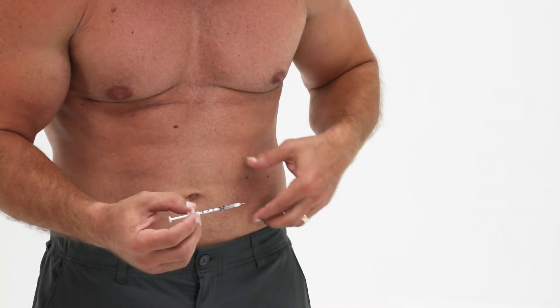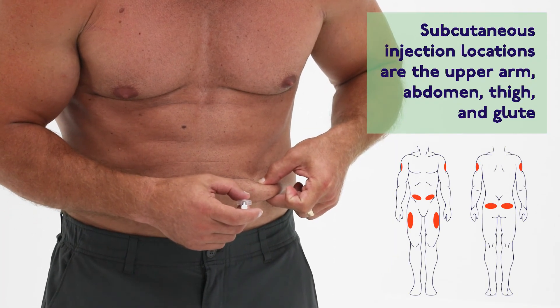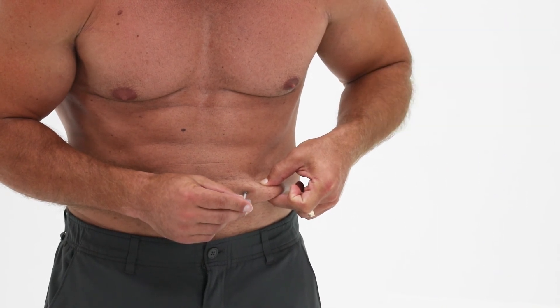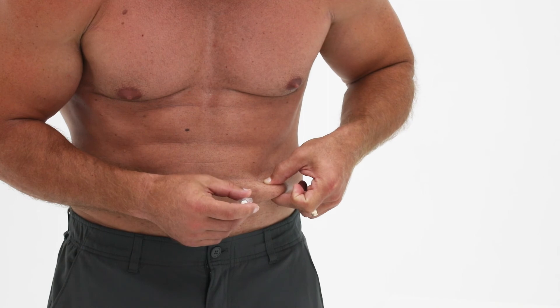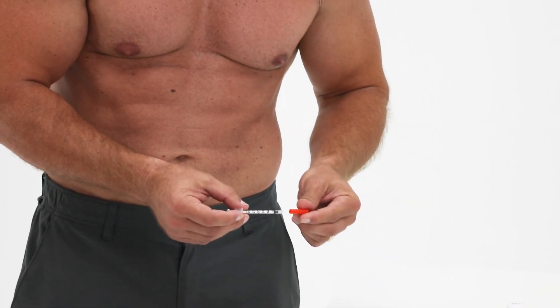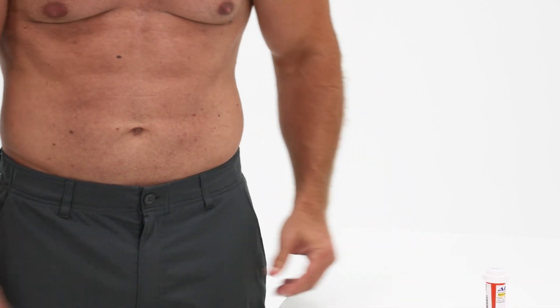Pinch the area of injection on your body about 2 inches high and wide. Hold the needle at a 90 degree angle, pierce the skin, and carefully inject the medication. Lastly, carefully take the needle out, place the injection needle caps back on, and discard in a sharps container or a hard plastic container with a screw on top.